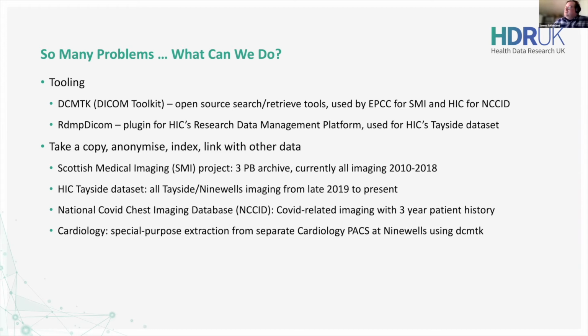So at the beginning of last year, when NHS England started this project to gather all of the chest imaging they could, nobody had access to all of those PACS systems. They would have to go around hospital by hospital asking the radiology departments to please send all their COVID chest imaging to a central point. So that's quite a challenge.